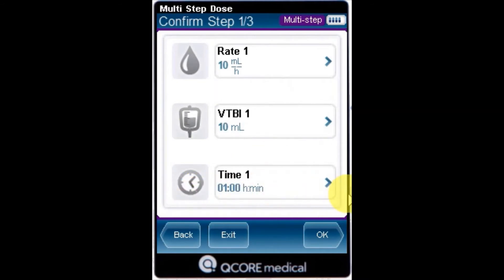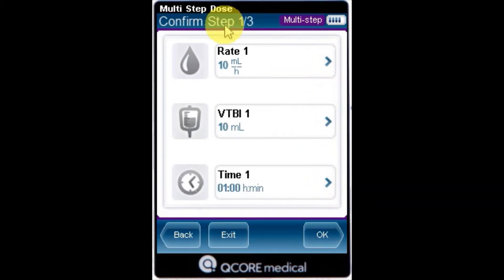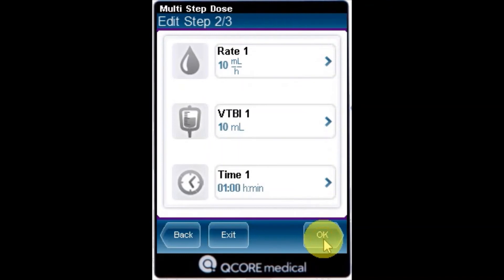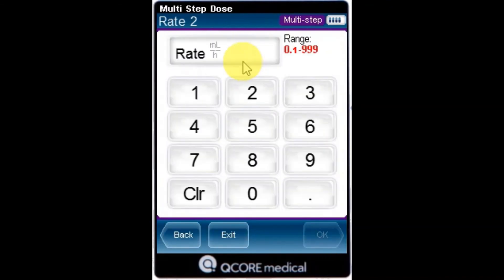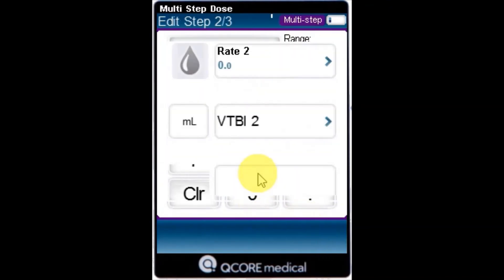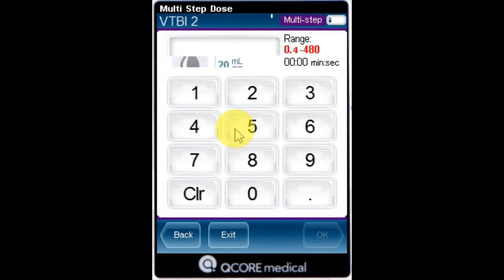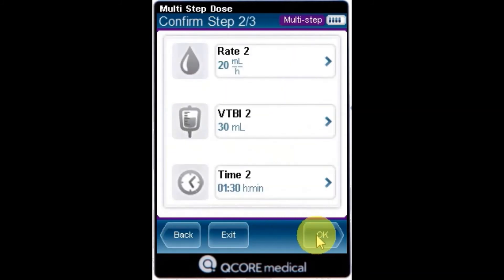After reviewing the infusion parameters for the current step, as displayed on the indicator bar, press OK to proceed and then program the next step. To program parameters for the remaining steps of the infusion, repeat these steps.